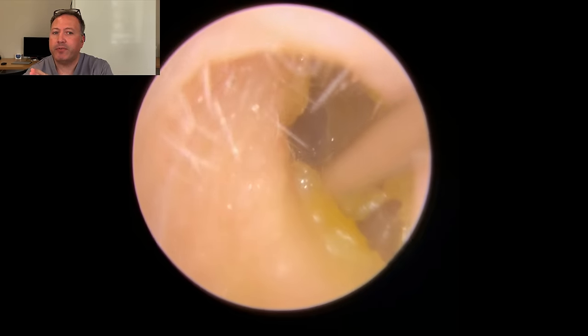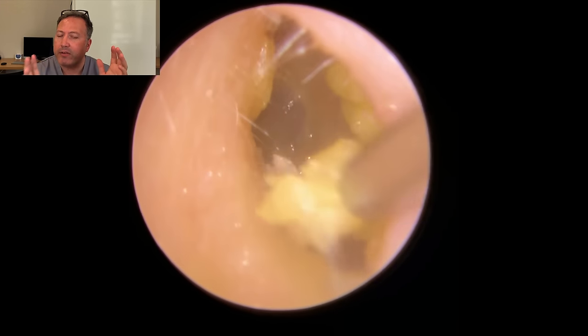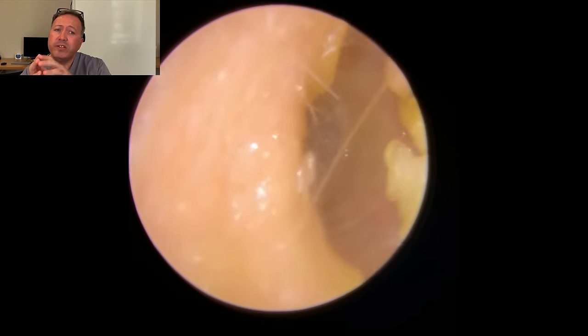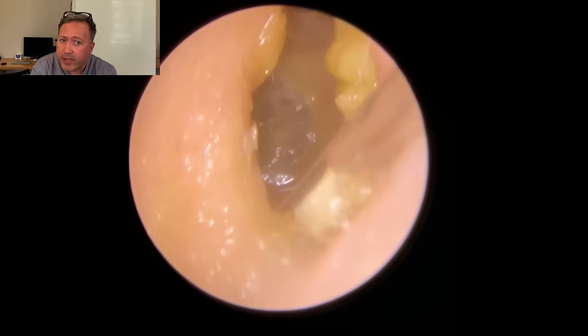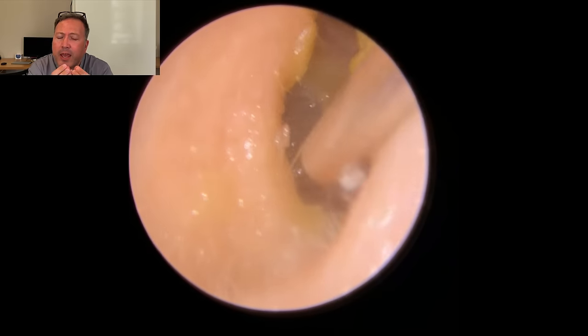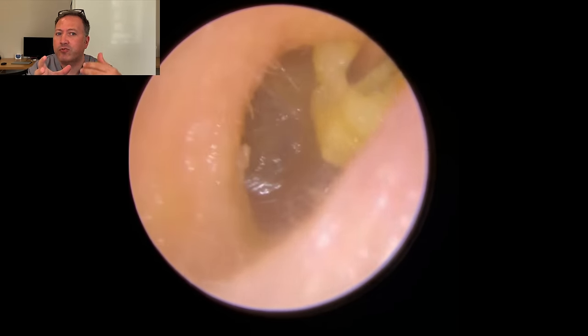Now, this lady came through to clear it. She's a keen swimmer, and noticed when she was going swimming, her ear canals weren't clearing very well with water coming back out. So I think the reason for that is the water was getting through those two little holes you could see and sitting behind that thin spiderwebby type skin, just pooling back there. So it was taking a long time for that to dry out and evaporate out.